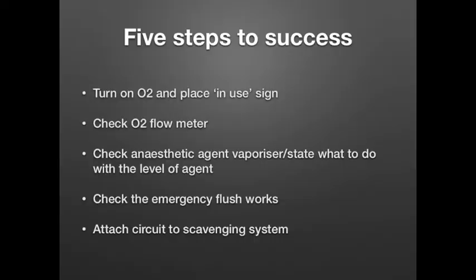There are five steps to success for this part of the test. Turn on your oxygen and place the in-use sign. Check your O2 flow meter. Check your anaesthetic agent vaporiser and state what to do with the level of the agent. Check your emergency flush works. And attach your circuit to the scavenging system.